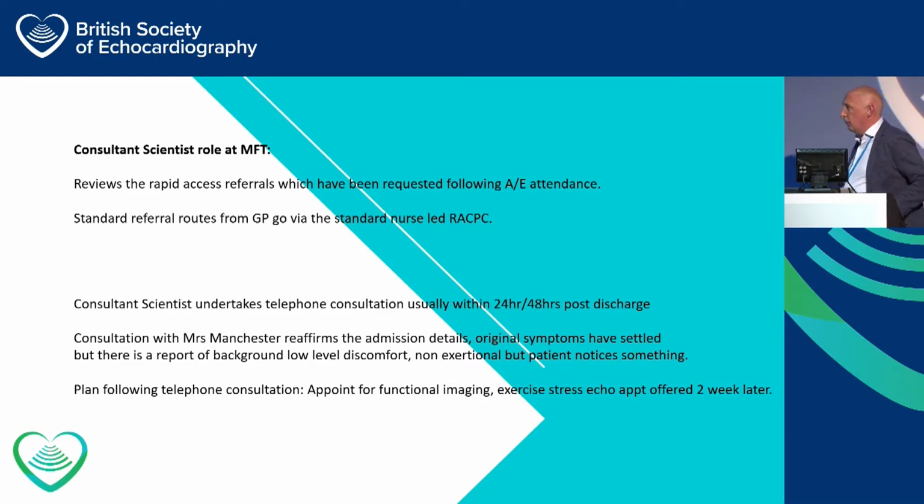And after his consultation over the phone with this particular patient, he reaffirmed that the admission details and the original symptoms have settled down, but she does report a background low-level discomfort, something not quite right. Non-exertional, but notices it just sometimes. So he chatted to her and decided, we're going to bring her in anyhow at some point and we'll set her up through the rapid access chest pain clinic. And for this type of patient, we often use functional imaging and access to exercise stress echo. And in her case, she was offered an appointment within 2 weeks.